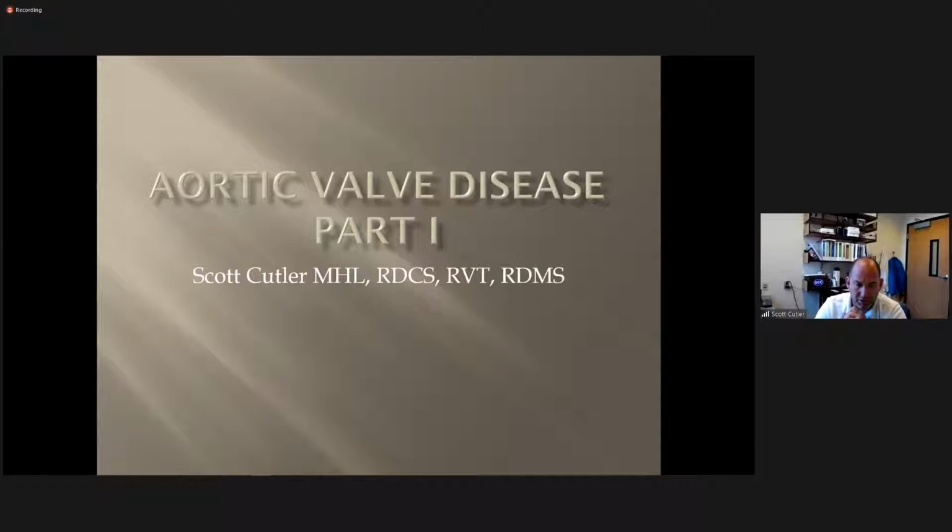Because in reality, in a clinical situation, if we don't see it, the doctor doesn't see it, and it's very, very important that we do have that critical thinking step. We can take a picture of a tricuspid valve, for example, in long axis and in short axis and in four chamber view, but does that mean that you saw the pathology that was there? I can show you lots of pictures of a tricuspid valve, and I can be off the slice of where that regurgitation is occurring. I could be not showing the correct leaflets that actually have the disease state, and I can miss it completely if I didn't sweep through my image gradually looking for that specific pathology.